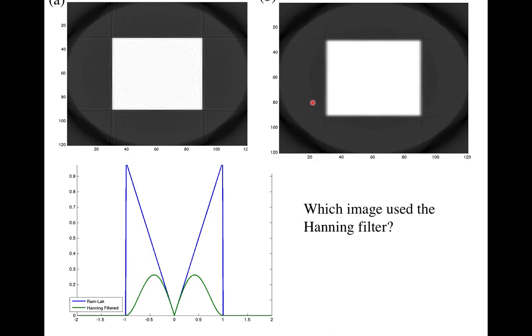Still, if you understand what the filter is doing, you can say, well, halfway up this hill, I will call that the edge, right? And so there are ways you can define it such that that's still your discrete number that you're going to call an edge.